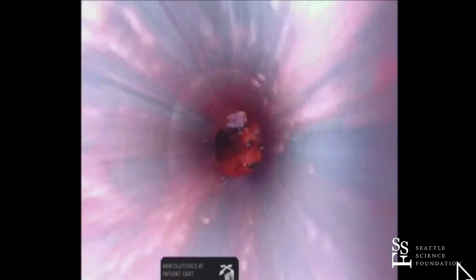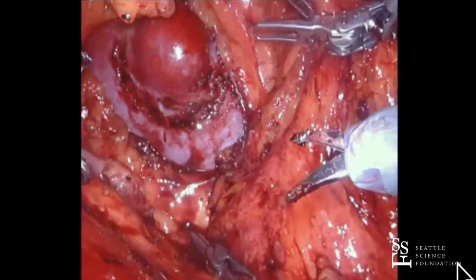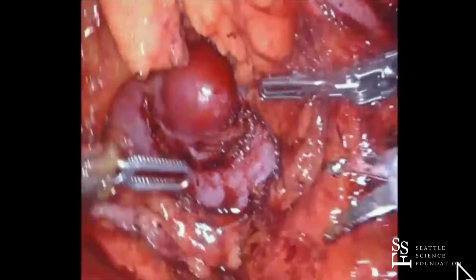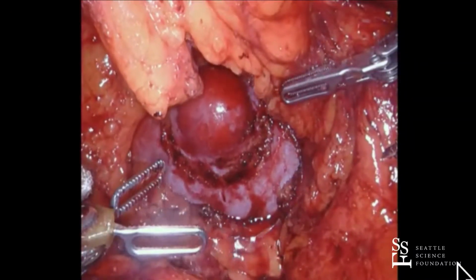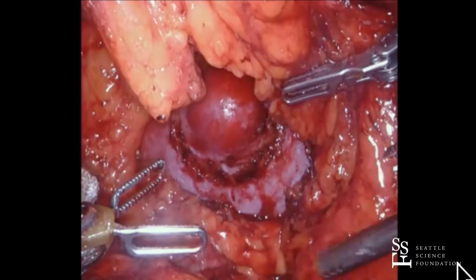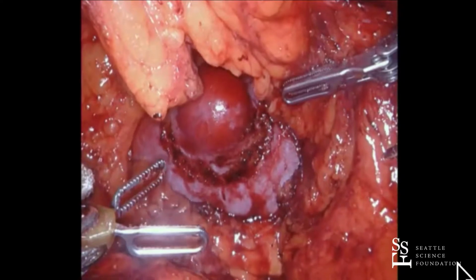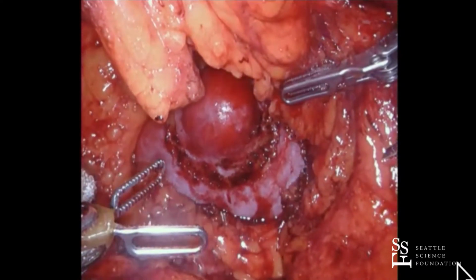Do you think there's any clinically relevant loss of compressive force in these patients over time, or is it a non-issue? People have studied that. The question was whether the bulldogs lose compressive force over time, and they actually do. Keep in mind that usually you're using the tip of the bulldog, which is the least compressive portion of it. So over time, they can lose compressive force.